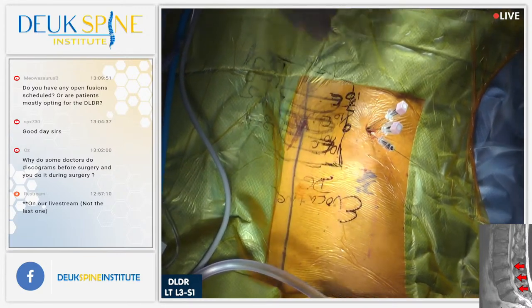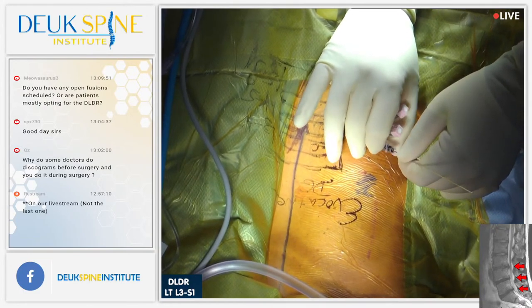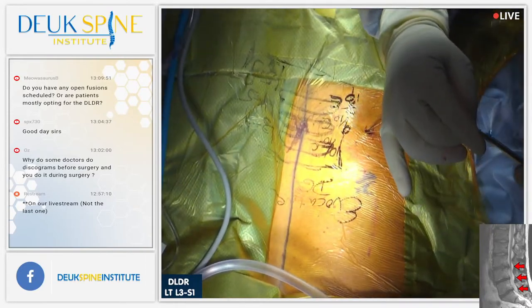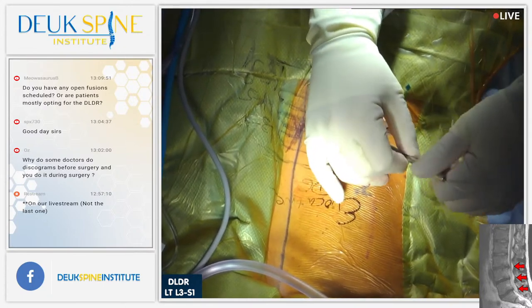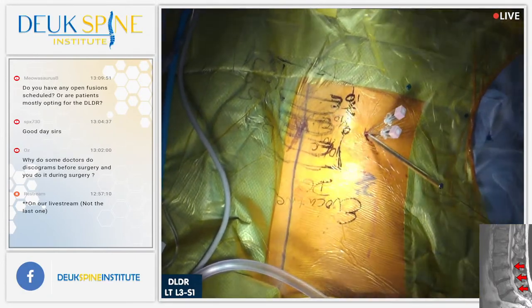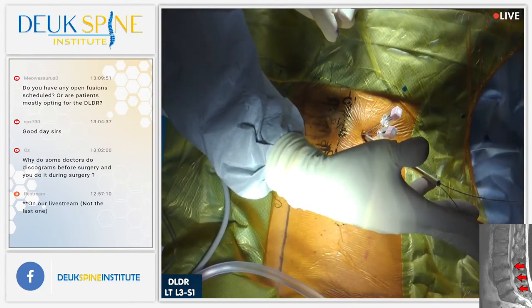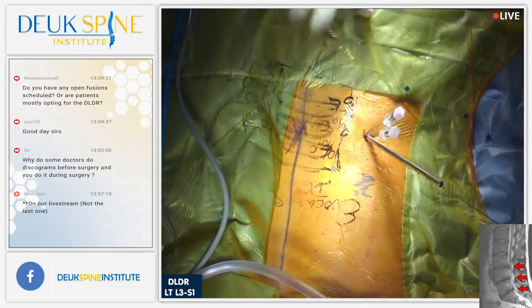Just keep counting. You're doing great, my friend. So at this point, we're going to place our guide wire, remove one of our needles at 5-1. We're going to place the dilator. The dilator is not going to harm the patient. It's going to spread his muscles and fascia, giving us a pathway. You're doing great. All right, Henry, you want to run the video showing the audience how the Deuk laser disc repair procedure actually works. Keep counting out loud, my friend.